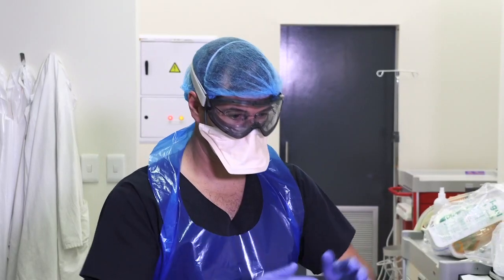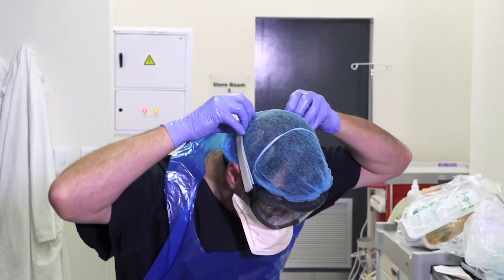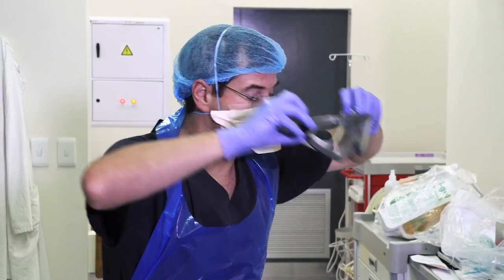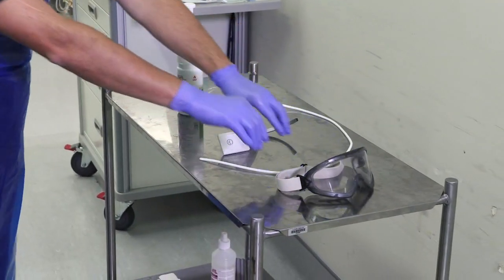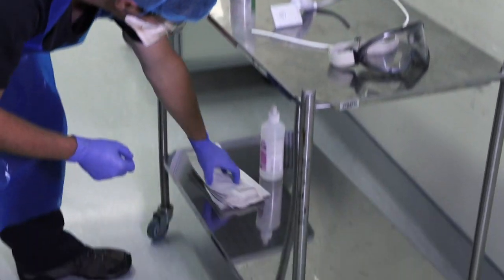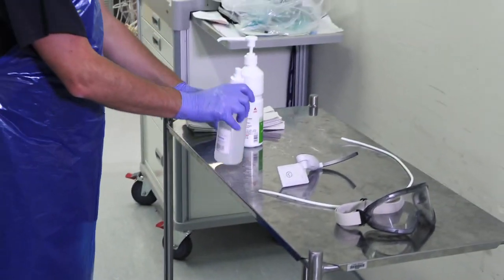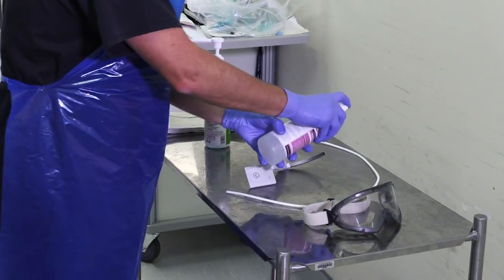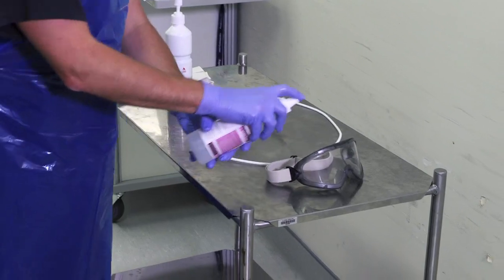Please remove your goggles and place them on the trolley. You may now use surface disinfectant to disinfect the trolley and the goggles. Everything that's been in the theatre is contaminated and so the whole trolley must be disinfected.